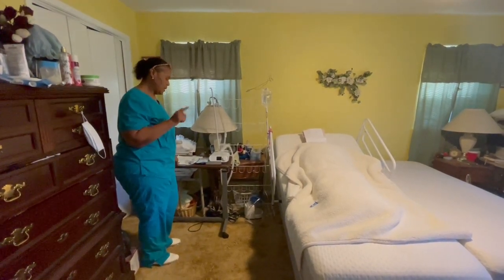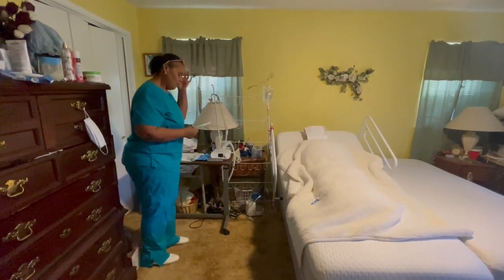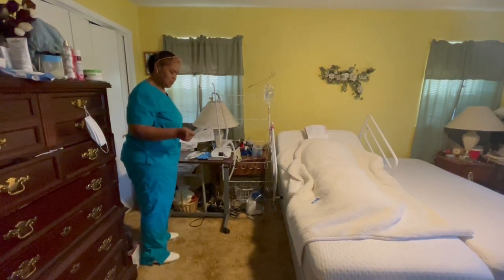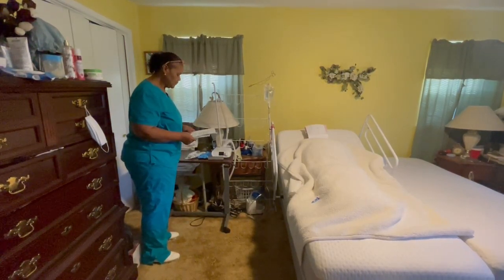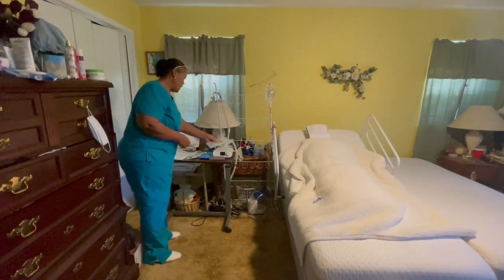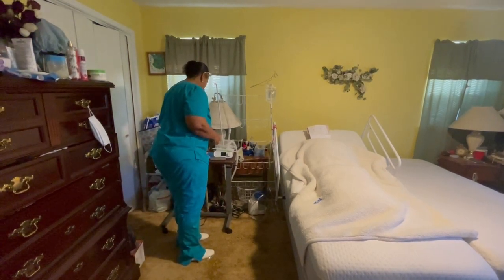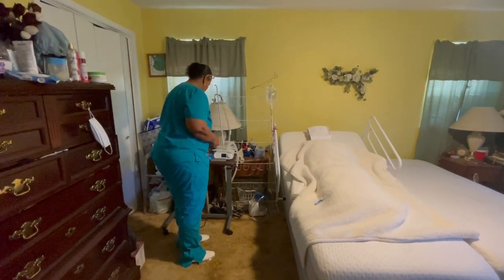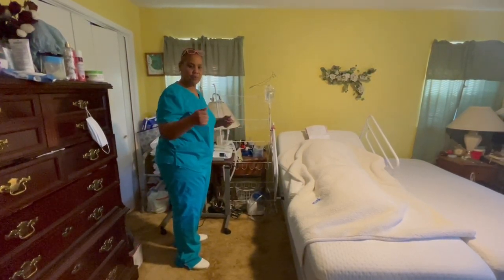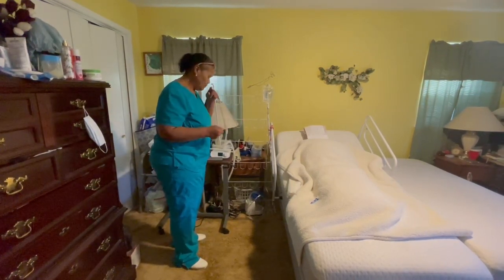Once I hit the button on that, I will be pulling out my Rocephin. I will verify my Rocephin with my order. So it's going to be Rocephin 1 gram. My order says Rocephin 1 gram IV. So I have that. I'm going to make sure I have all of my supplies when I go in the room. A lot of times in different facilities, they have the medication computer that you can pull into the room with you. So I'll take that in.